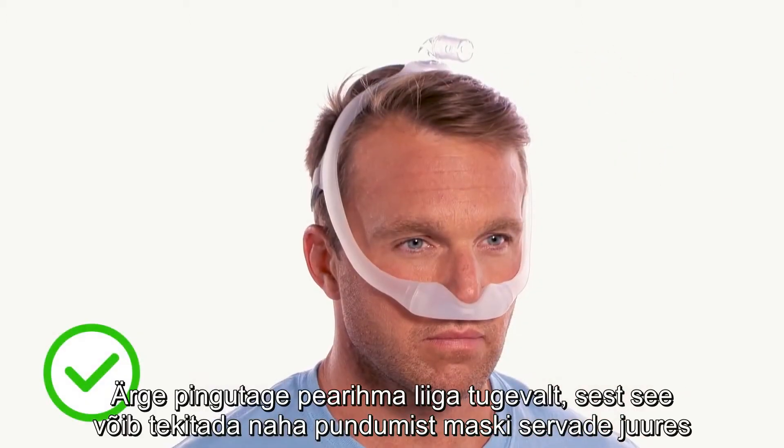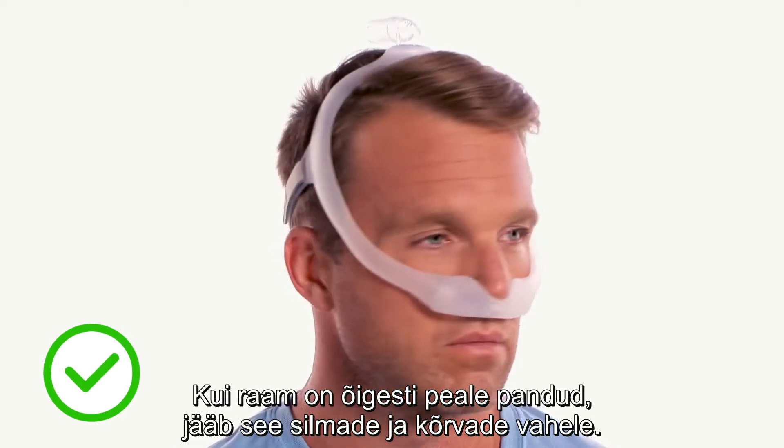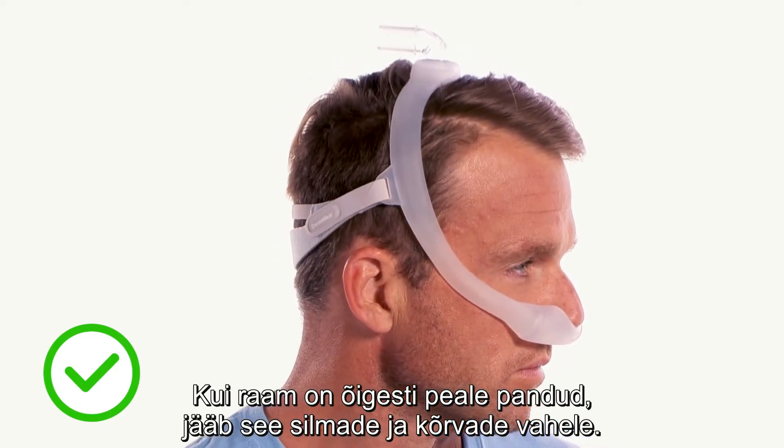Be careful not to over-tighten, which may make skin bulge around the edges of the mask and cause redness or abrasions. When seated correctly, the frame will rest between the eye and the ear.